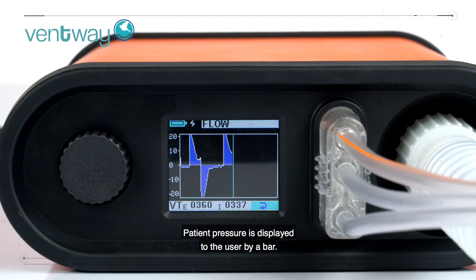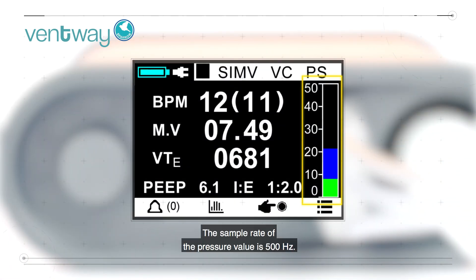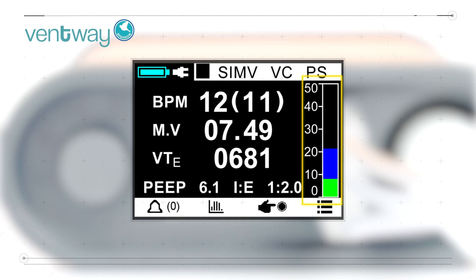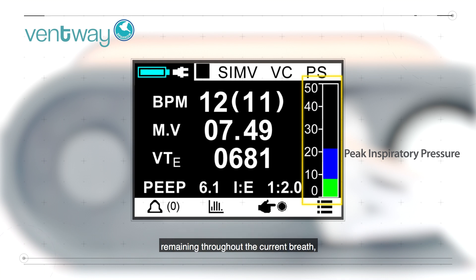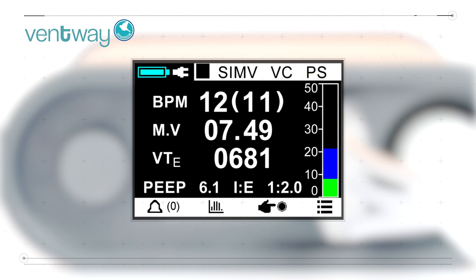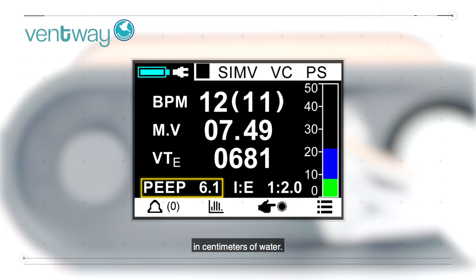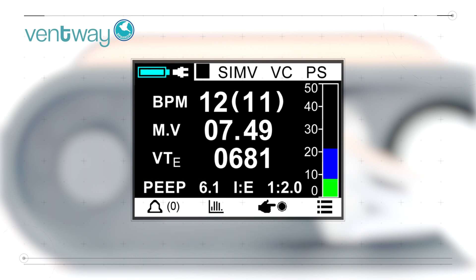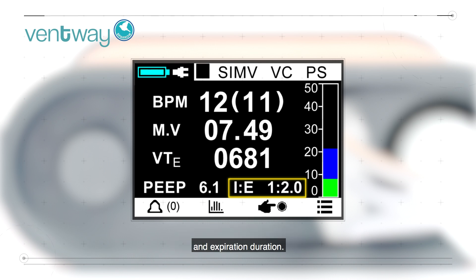Patient pressure is displayed to the user by a bar. The sample rate of the pressure value is 500 hertz. The peak inspiratory pressure is displayed as a blue background, remaining throughout the current breath, while the current pressure is displayed in green. The PEEP indicator is a representation of the positive end expiratory pressure in centimeters of water. The I to E ratio is a representation of the ratio between the inspiration and expiration duration.